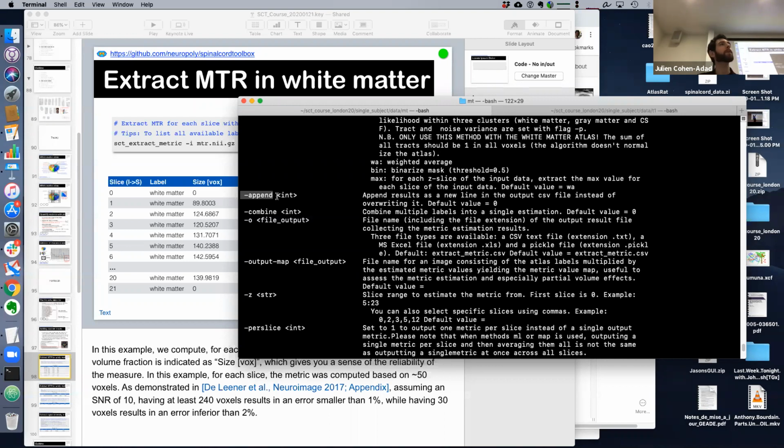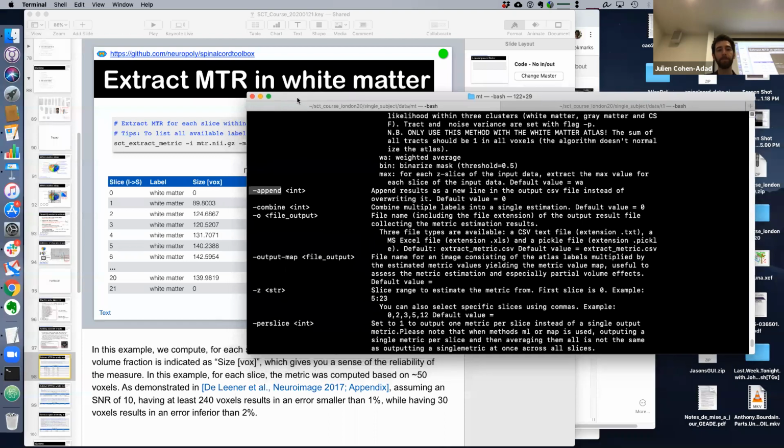Yes, Ferran? This thing of the voxels, how can you report a variable that is displayed like the voxels percentage? Is that the partial volume of the segmentation? It is. It's saying size, and the unit is voxels. Correct. And then the voxels in the image is 1 or 2 or 3. Yeah, and not 2.57. So I see what you mean. We are dealing with soft masks. Okay, so it's a partial volume weighted mask. Let's clarify for the people. Absolutely. Yeah, good point.